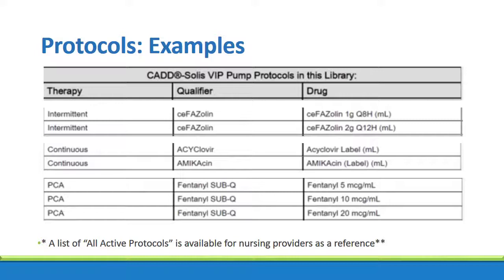A generated report called All Active Protocols is a great tool to identify what is in the library and what is not. This document can be shared with the nursing agencies as an electronic PDF.